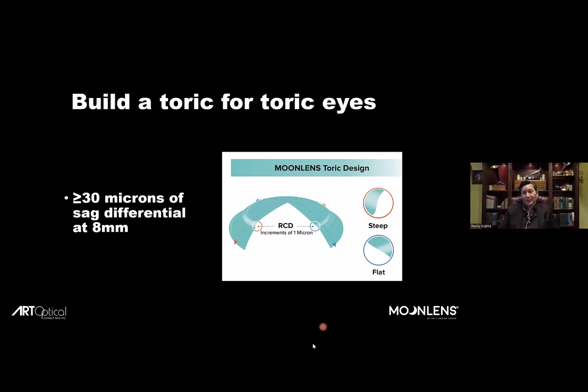So that's a really nice benefit for each of our patients, because we're not choosing, do we pay the extra money for a toric lens for this patient when they're really borderline? They might be able to fit well into a symmetric lens. There is never a downside to forcing a toric lens on an eye that has even a small amount of toricity. You just improve the peripheral alignment.